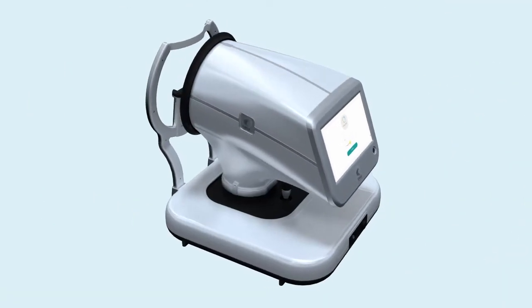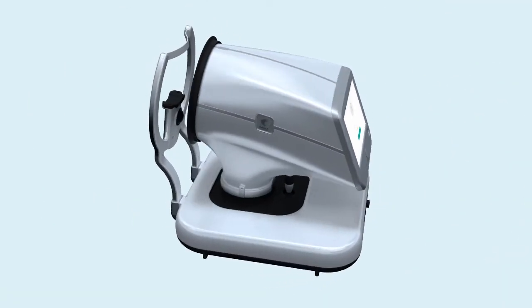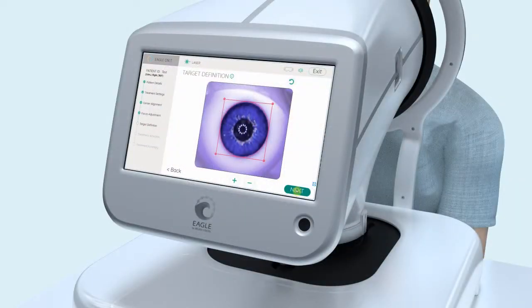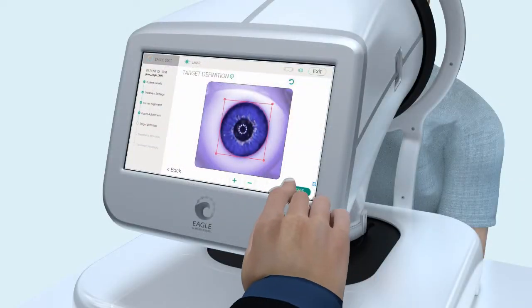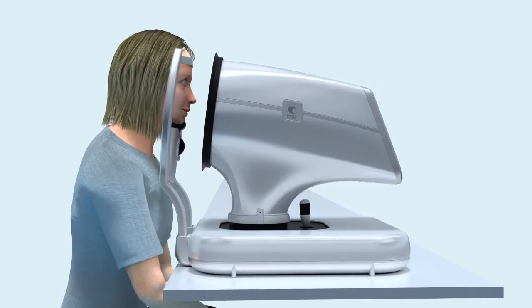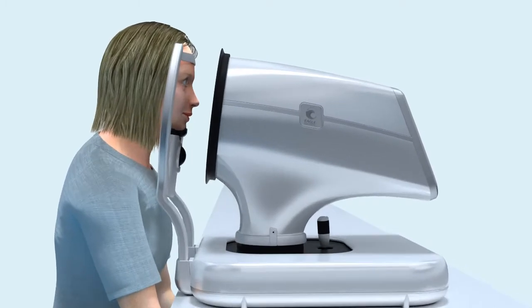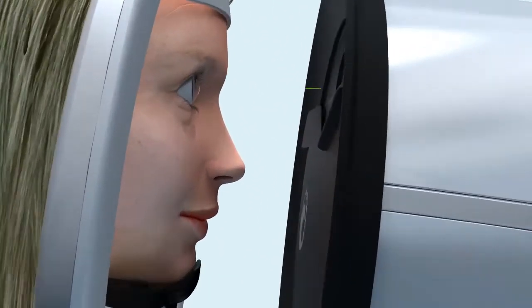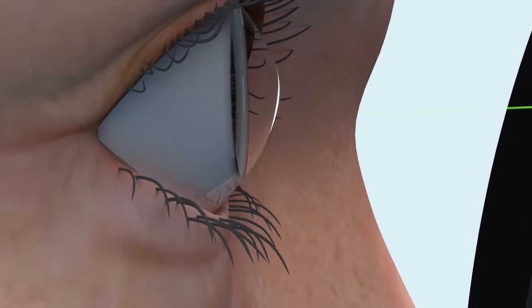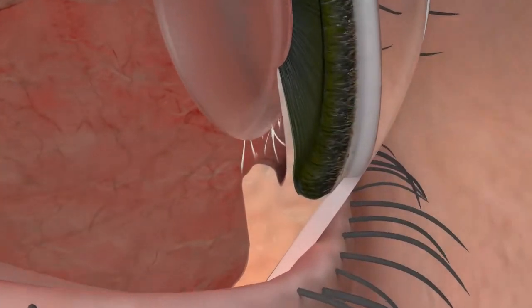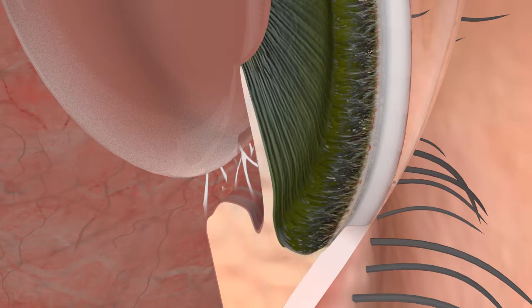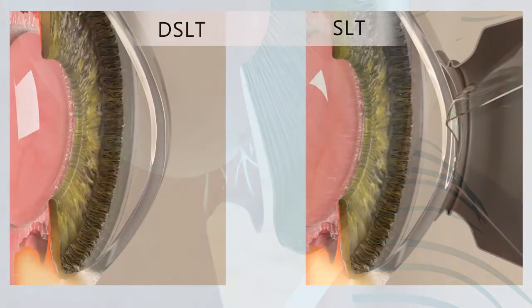DSLT is a disruptive technology developed to actively treat the trabecular meshwork. Our treatment algorithm and active eye tracker places a 400 micron beam on the limbus, and as the laser energy penetrates the ocular tissue, it scatters, forming a cloud of energy reaching the trabecular meshwork. To better understand, let's look closer.